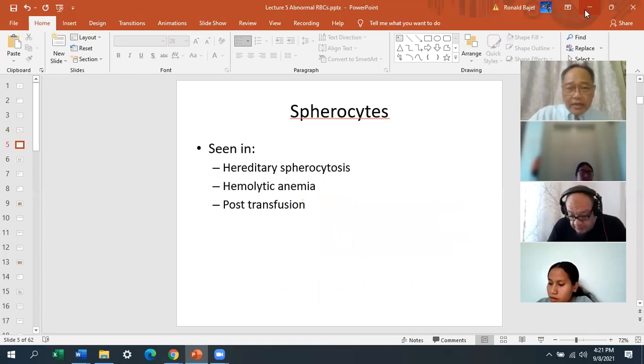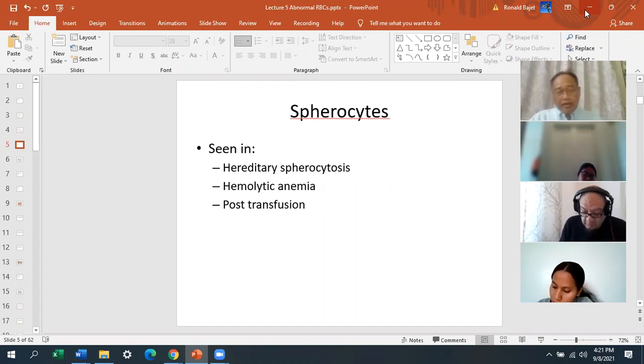Okay, spherocytes, seen in hereditary spherocytosis. It's seen in hemolytic anemia and post-transfusion. So hereditary spherocytosis is the disease, and the type of anemia is hemolytic anemia, because there are different types of hemolytic anemia. In spherocytosis, you have a lot of spherocytes. So remember the shape of these cells. These are spheres. Okay, it's not a biconcave disc. These are balls. These are spheres.